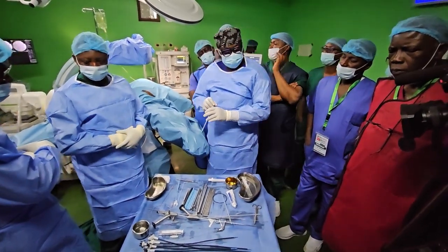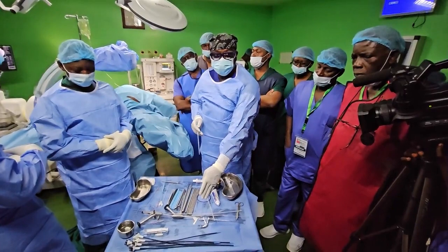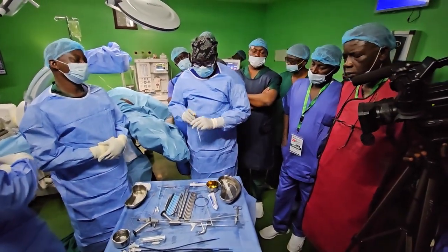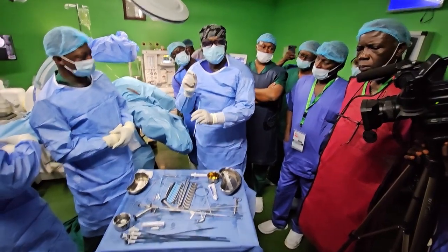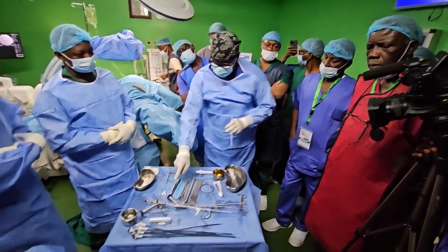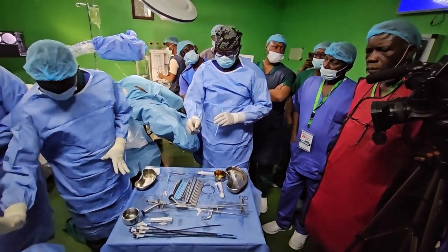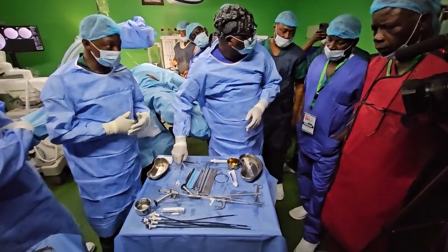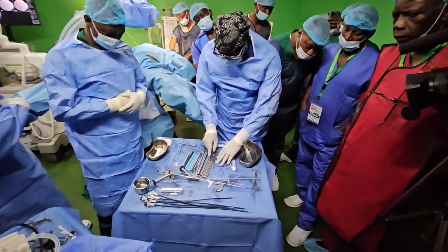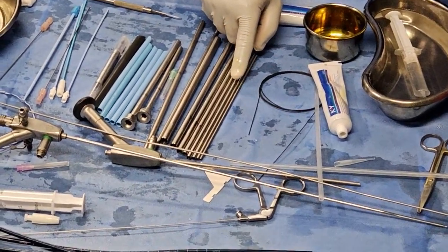But if you do telescopic dilatation, you can use Alkens. Once your guide wire is in, you put this rod over your guide wire into the system, and then these are the followers. These are different sizes of the Alkens.